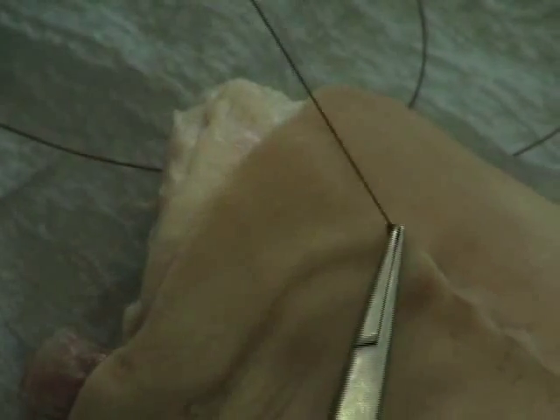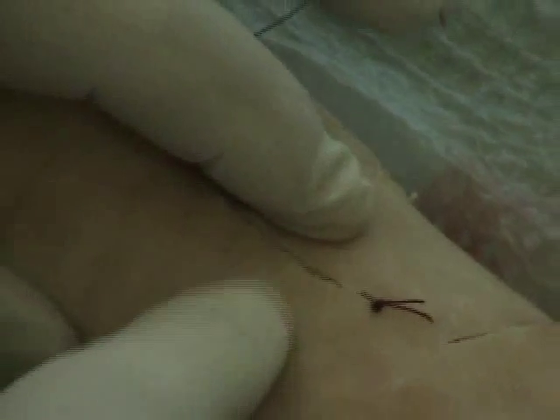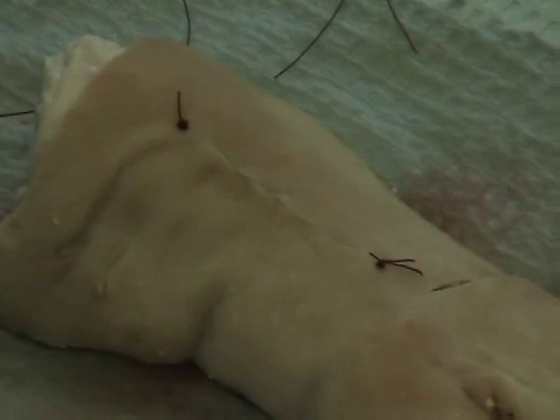Second wrap, then the third wrap, grabbing the loop. This would then be followed by steristrips placed across the incision. As you can see, it can be pulled open a little, so the steristrips go across and keep it contained and controlled until healing has taken place.